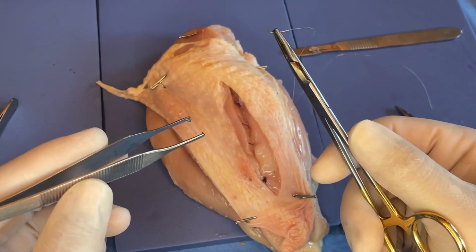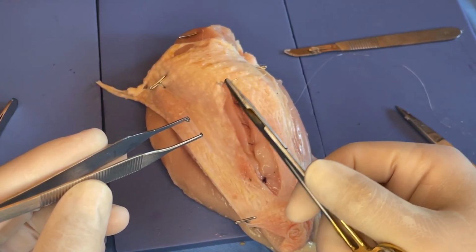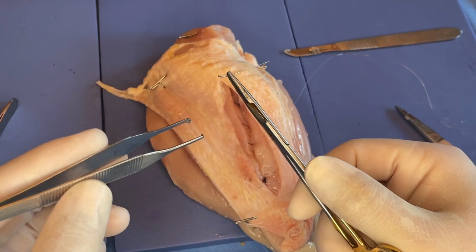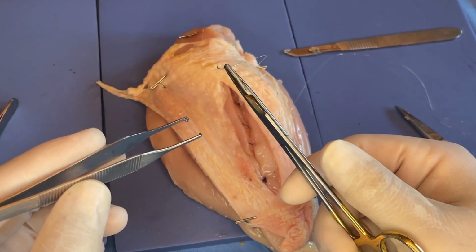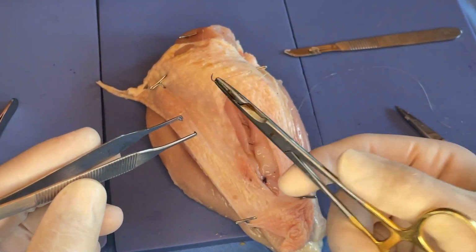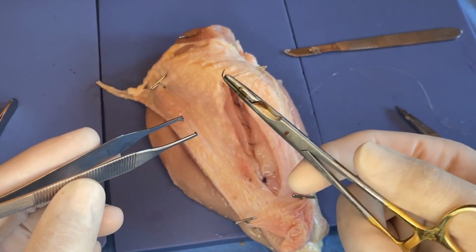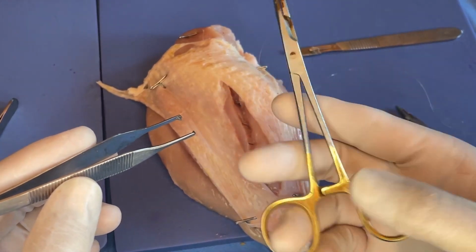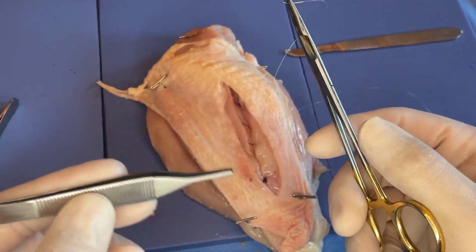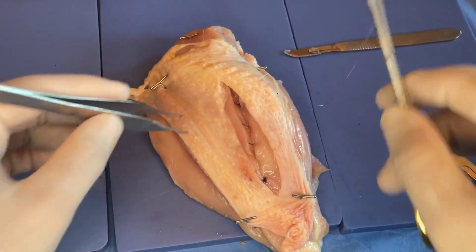So with our real large suture, large needle, heavy tissue like fascia, we would use a heavier forceps like the Ferris Smith or the Bonney's. When it comes to fine work with maybe a 3-0, but certainly with the 4-0, having a smaller needle driver is nice. Having the smaller tipped forceps, this is kind of an Adson, is nicer.